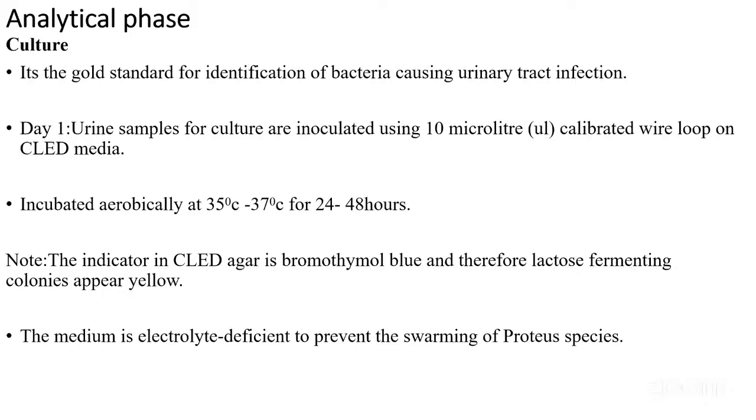After you have inoculated the urine onto the CLED media, you should incubate it at 35 to 37 degrees for 24 to 48 hours.